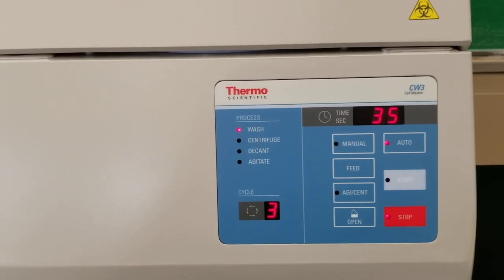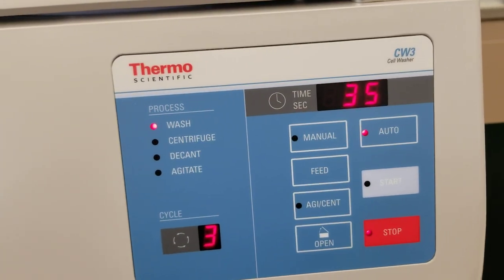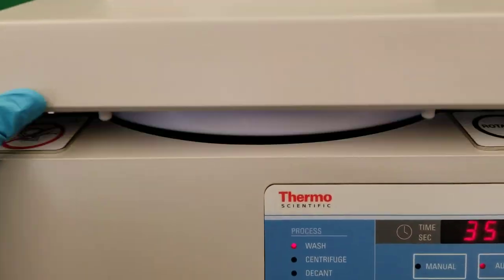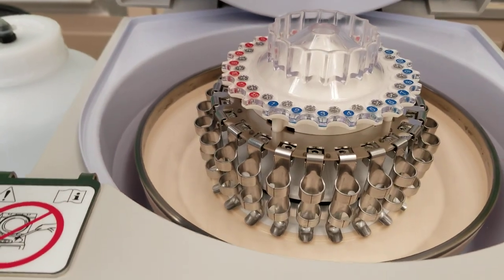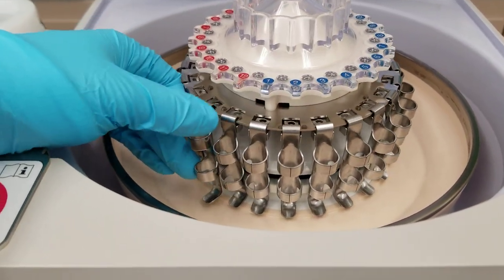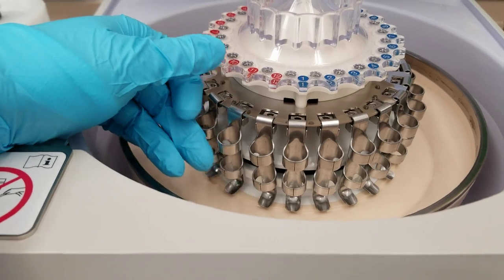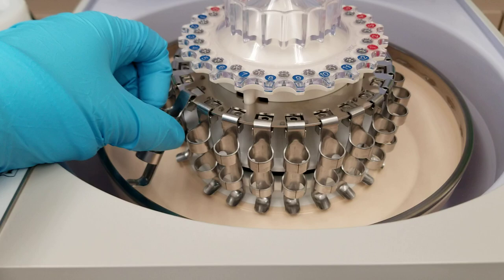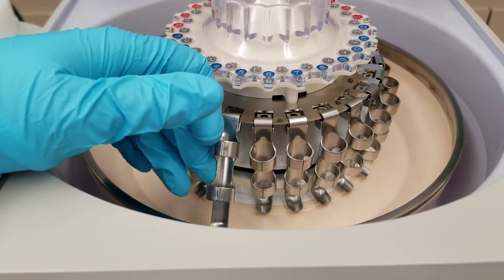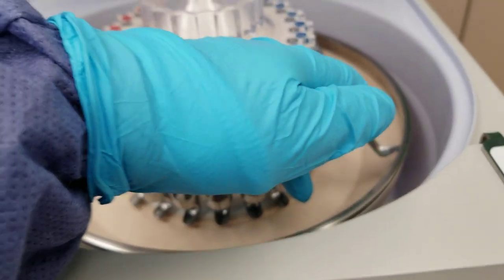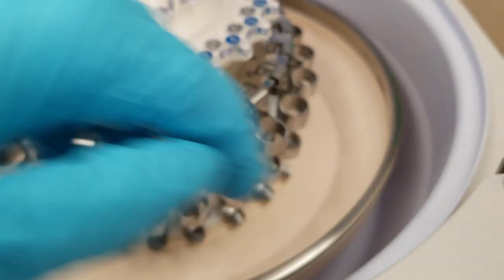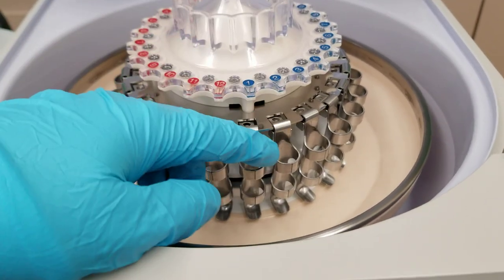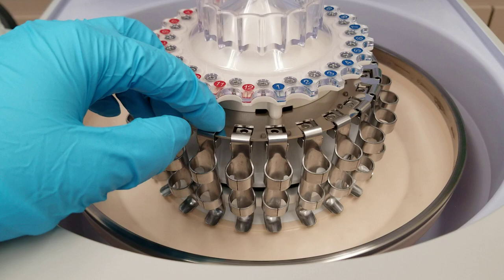So this is the Thermoscientific CW3 cell washer. If you open it up, it pops open like that. You'll see that there are 24 slots for the tubes to go in and they do swing out in this little bucket area to catch anything that comes out of there and also to stop this from going up way too high. So this is a fixed rotor but with a swing location for each of the tubes.